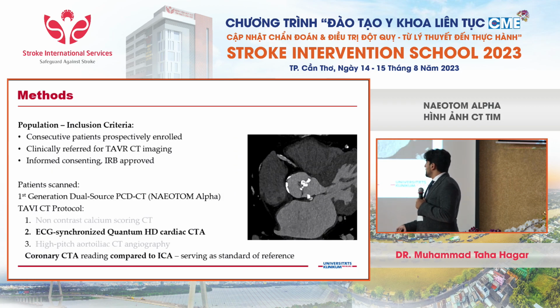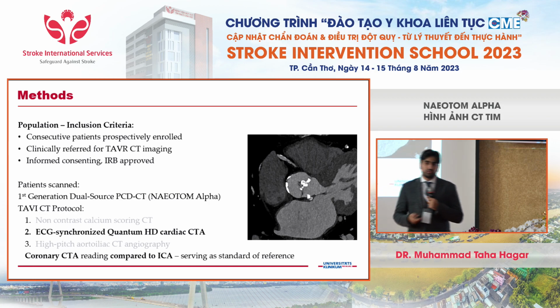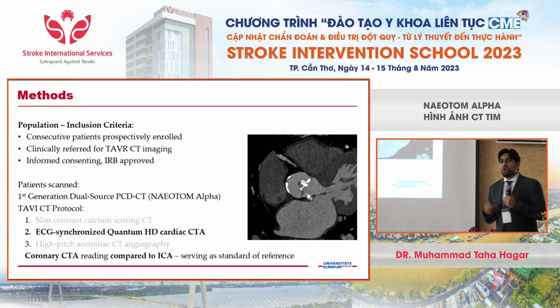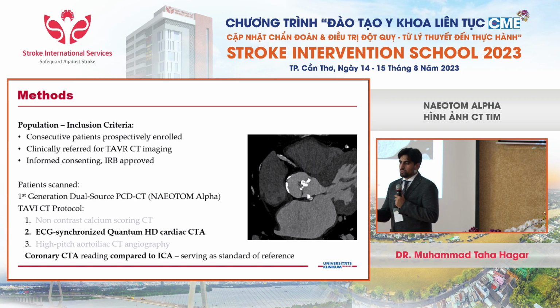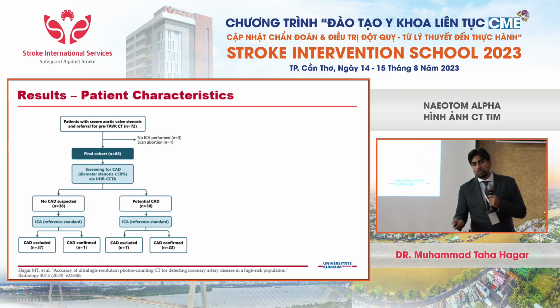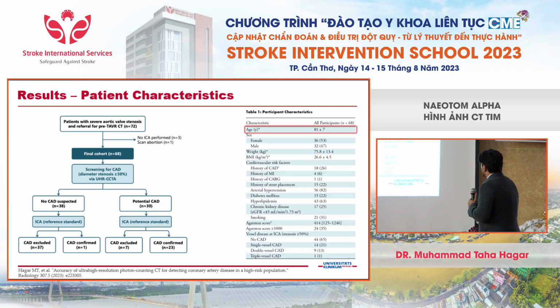artery disease. And all patients were consecutively enrolled and received an ECG synchronized photon counting CT scan employing the Quantum HD cardiac protocol, and we compared the results of the CT reading independently with the results of the invasive angiogram, which is always performed in this patient population. In the final cohort, 68 patients were included, so a small study, but nevertheless with meaningful results.